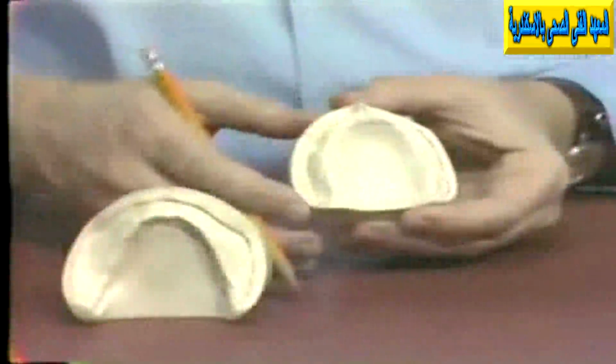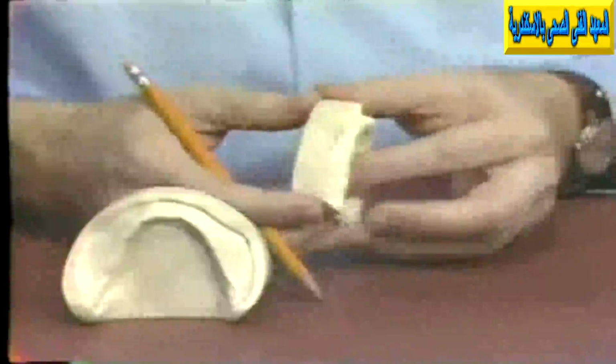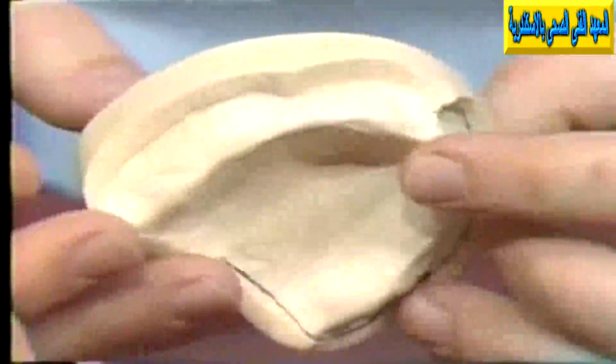A second requirement of a master cast is the thickness of the base. Now, as a general rule, we say that the base should be at least a half an inch thick. If it is too thin, we will have insufficient strength, and the master cast can easily break during manipulation or during the compression of the acrylic resin during the later stages of the making of the complete denture bases.